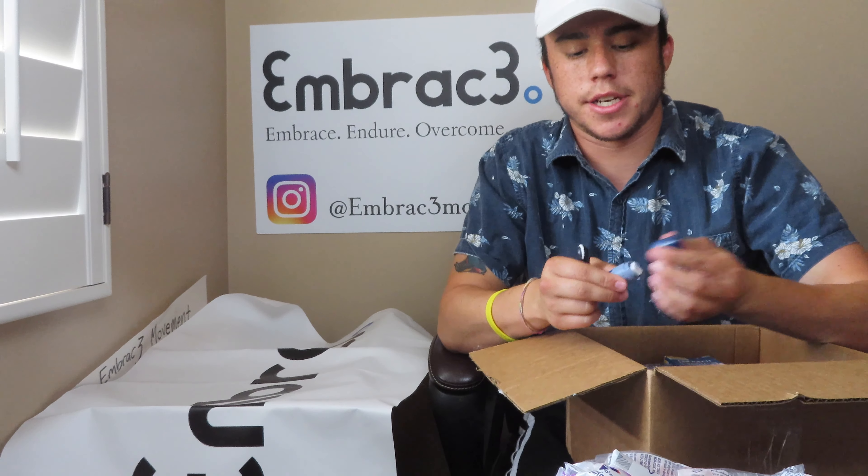A lot of people can't afford testers, and more commonly can't afford test strips, so they just don't test — they wait till they feel gross, take a shot, and it can get really bad. I'm very appreciative of the testers, so thank you for that. There are some lancets, and we have one, two, three, four, five testers — oh my gosh, it's incredible.